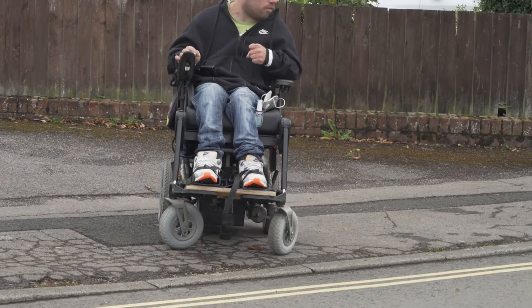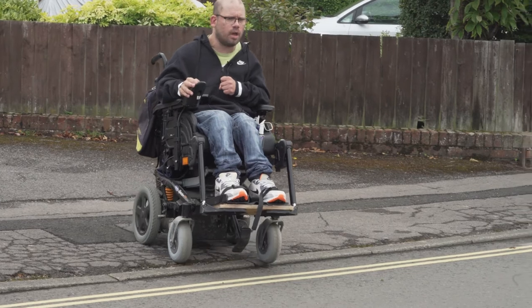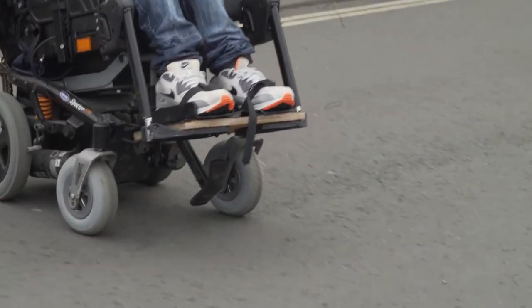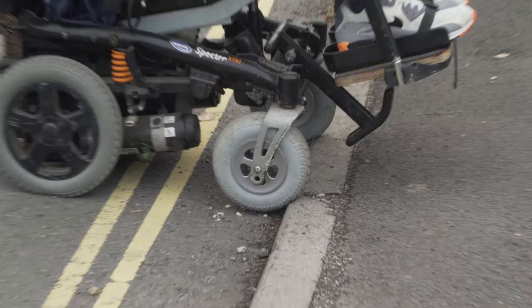I look to the right and look to the left. I have my chair at a slight angle so I can go, but I notice that if I'm going across I'll need to straighten my chair up. You've got to pick where the best place is.